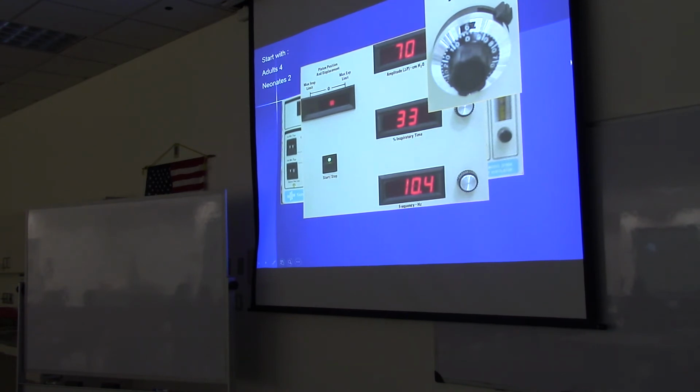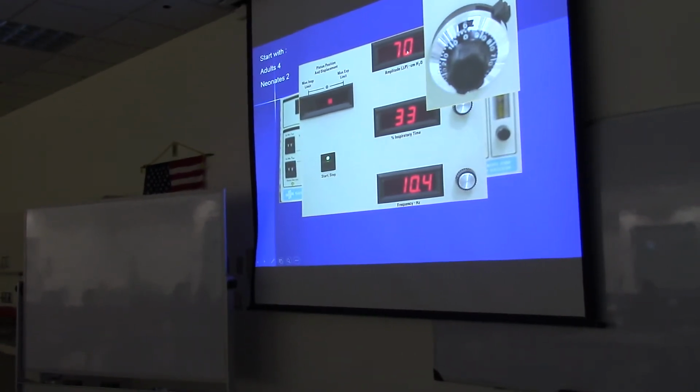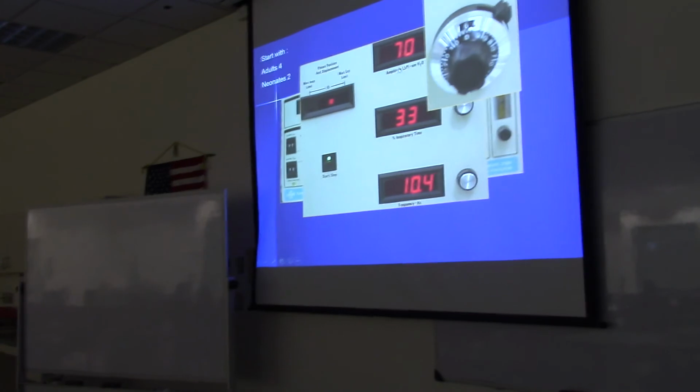So this is showing what the front of an oscillator looks like and the different measurements. So it's showing you just the power knob. So you crank up the power in order to get your chest wiggle. And then the more power, the higher the amplitude.